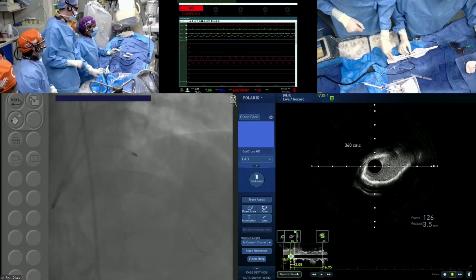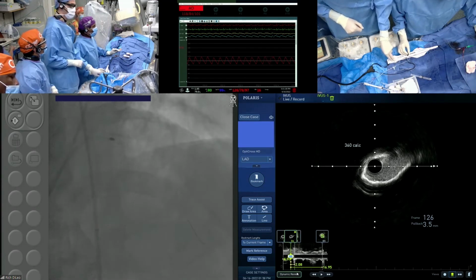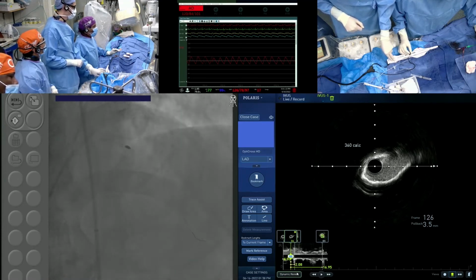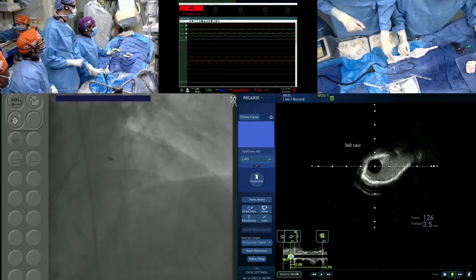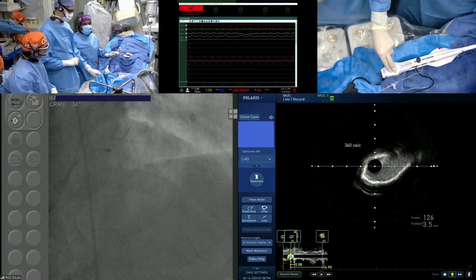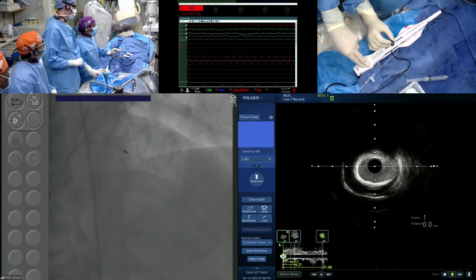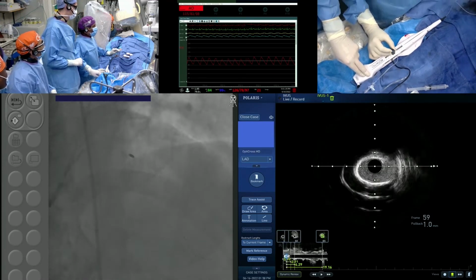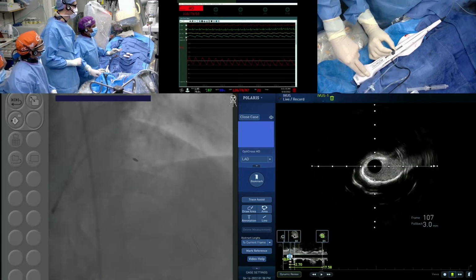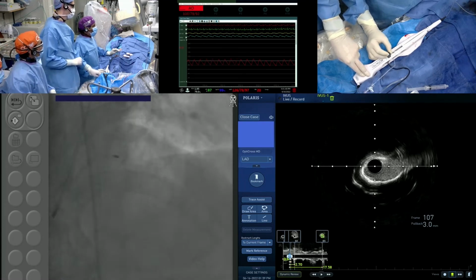Touch and come back, yes. We can't hear the burring. I don't know why. Is it stalling, or is it that we don't hear the burr? I don't know. Anyhow, we do see the burr advancing, and the slow motion is there. We don't hear the noise of the burr? No, we don't hear the noise of the burr. But we hear you. Let's recheck the volume connections from this room, please, AV team. Otherwise, this is a little bit of a silent movie.